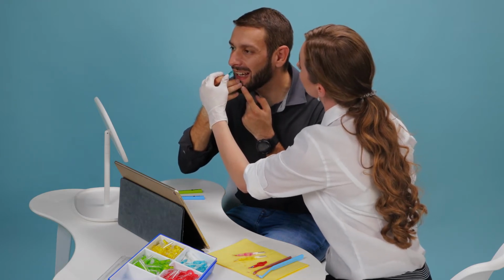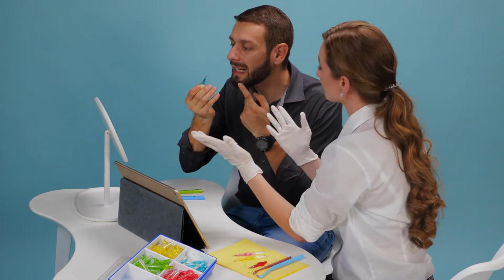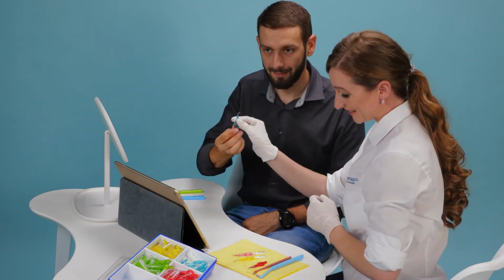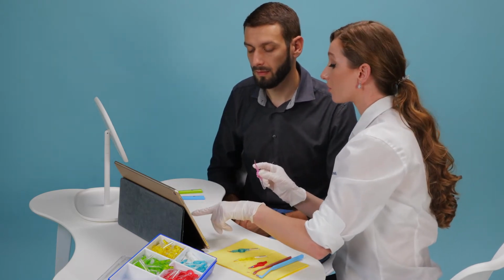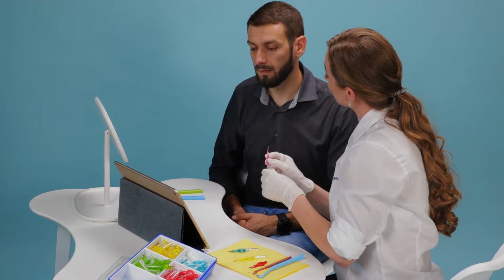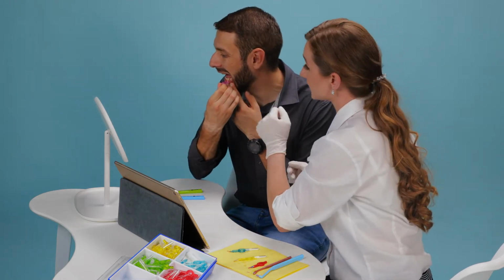I assist my patient by using touch-to-teach methods to help guide him into using the interdental brush in the correct technique. Once the patient is comfortable using the smallest brush, I then recommend the next brush size to be used in a different sextant. In Edward's case, it is the pink Prime interdental brush.